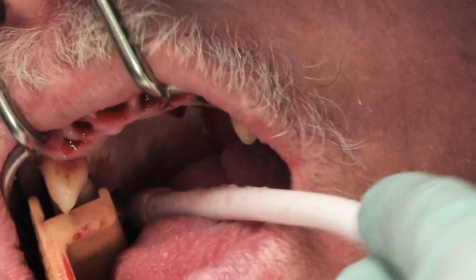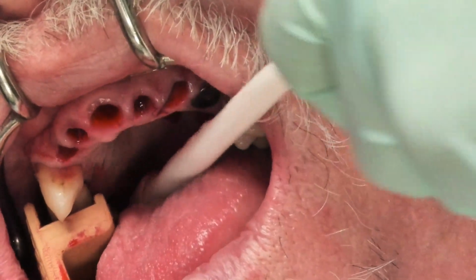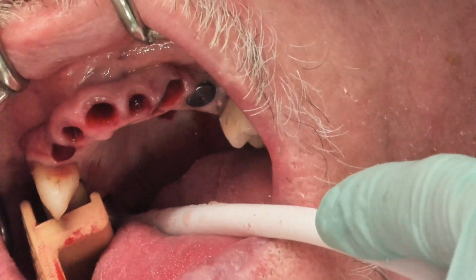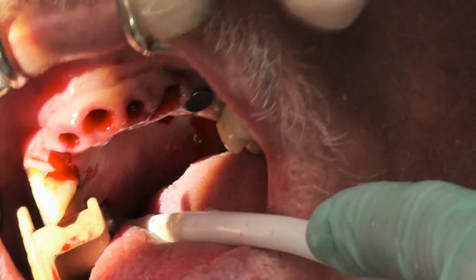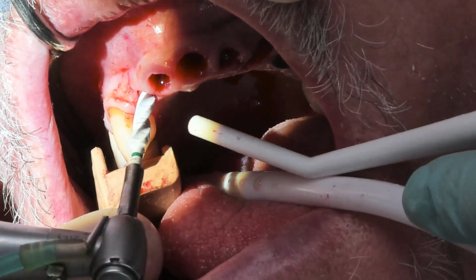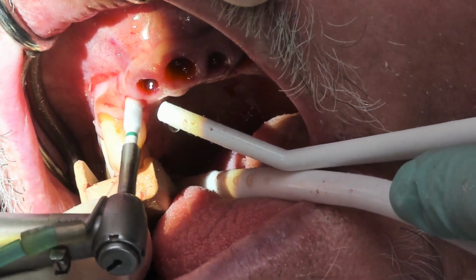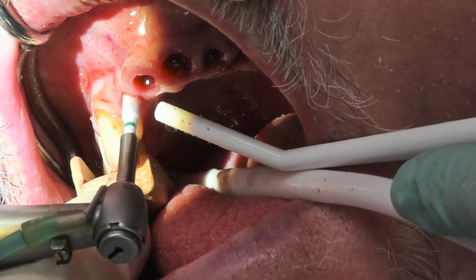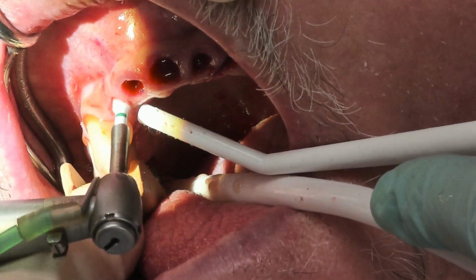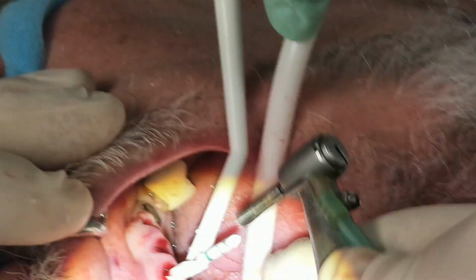Okay, we're good. All right, one second. I'm going to wind up to the 3-7-5 right away, because we want the softer bone technique. And you can see I'm kind of fanning my drill towards the palatal. I'm going full depth on that site.